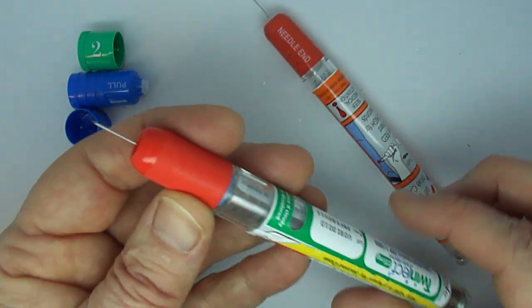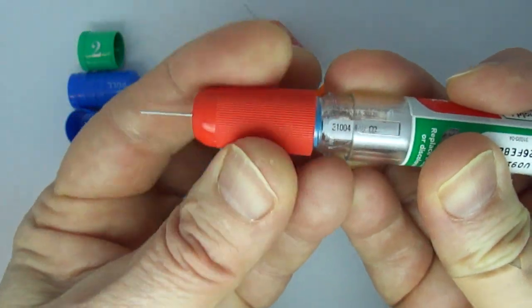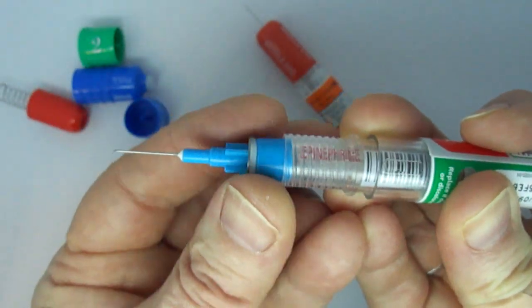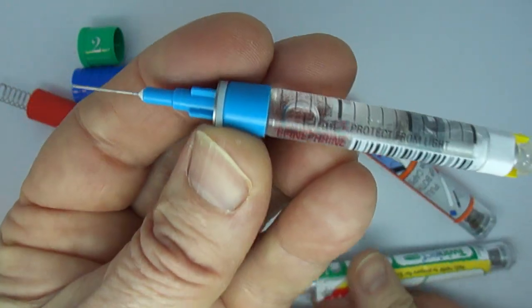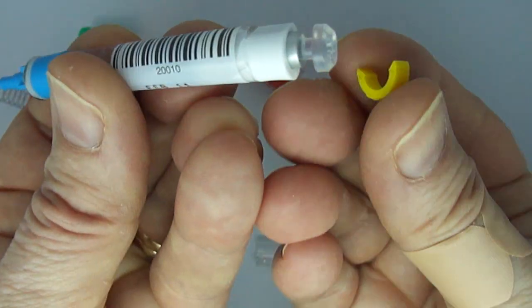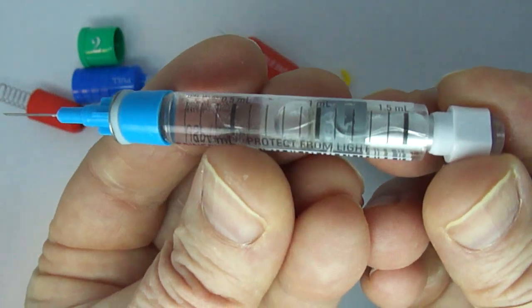The Twinject actually has a screw-off cap. So after you use it, you can screw off this cap, which gives you access to the syringe and needle inside. And if you take off this little safety piece of orange, you can then access additional doses.